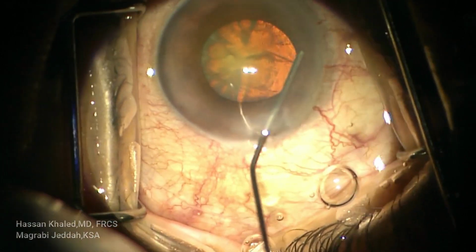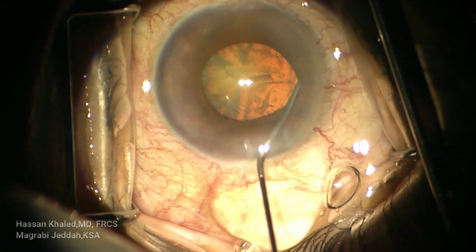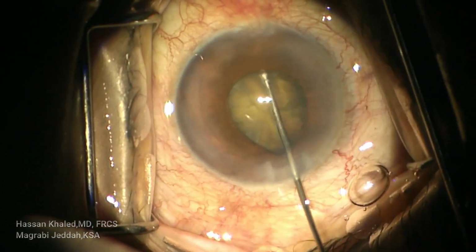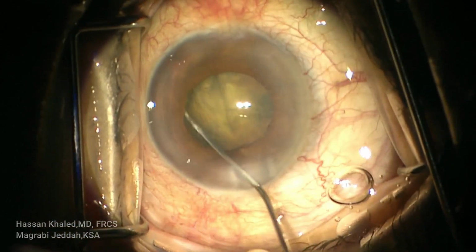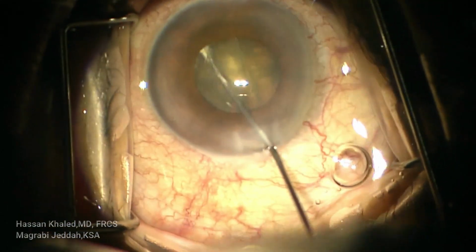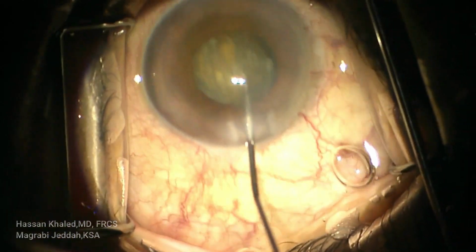Now you can see the hydrodissection. I can't see the edge of the rhexis. You can push the iris and inject the BSS until you see the wave. At this step you can see how the pupil is constricting. Now the pupil is about 3 millimeters. You can see the density of this type of cataract.